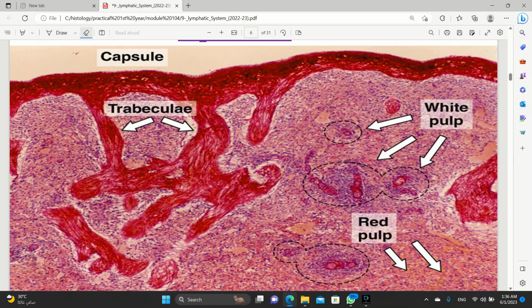That's the trabeculae. And the spleen doesn't have the parenchyma stuff. It just has white pulp and red pulp. White pulp are aggregations. This is how I memorize it. That's not scientific, but they're circular aggregations of some stuff. The red pulp is the rest of the stuff. So how do we memorize that? Let me write that down. The white pulp.